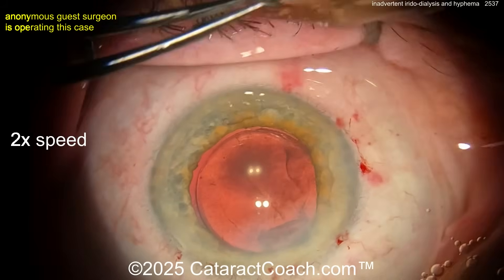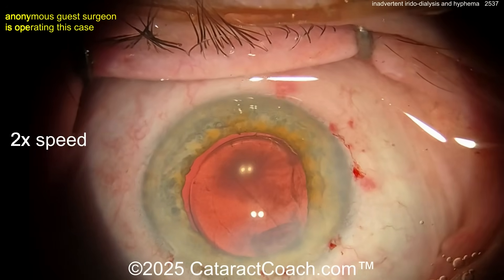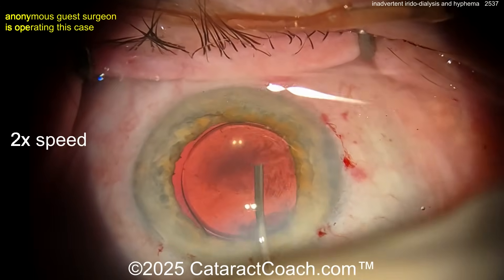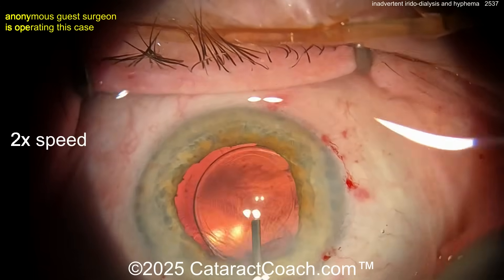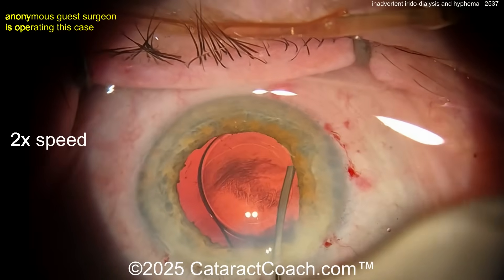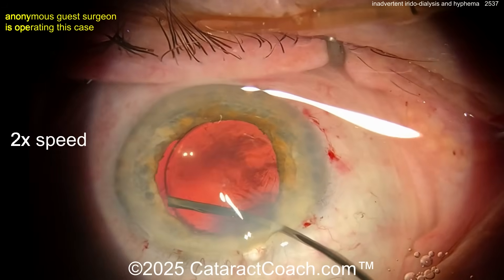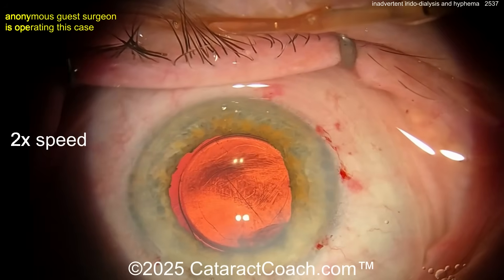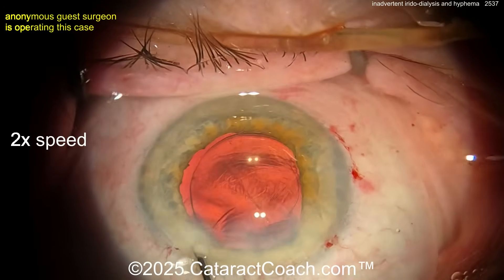If it keeps bleeding, what you should do to stop it: get the pressure up. You can temporarily put the pressure on the eye at 50 or 60 millimeters of mercury. You can put some epinephrine in the eye if you'd like — kind of washing it out a little bit. But there's still some blood that won't be washed out. Blood at the anterior hyaloid face is not going anywhere, so just leave it. Get the IOP up. If you want, you could put in some miotics.